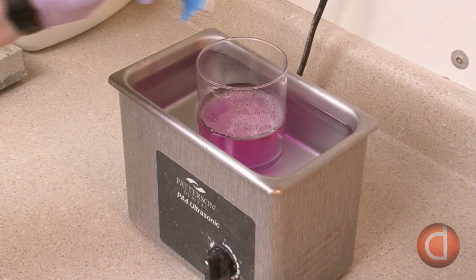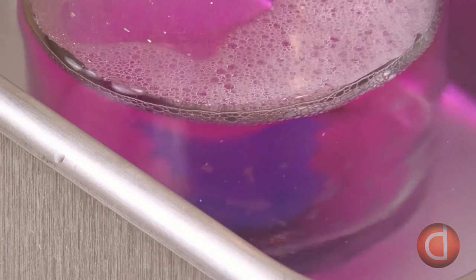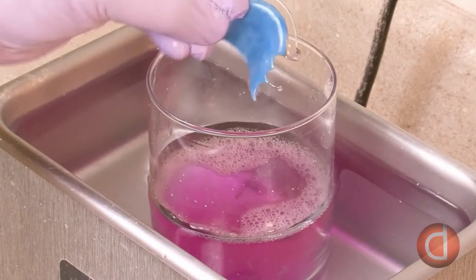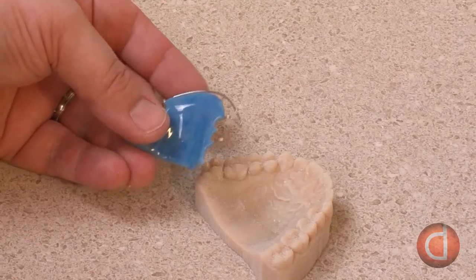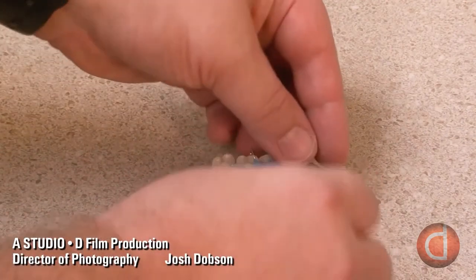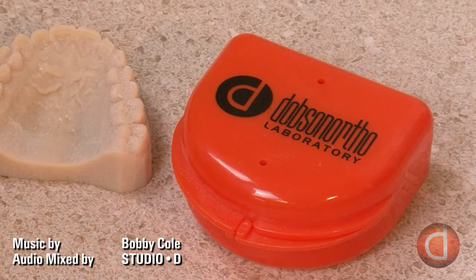The retainer is dropped into a mild acid in an ultrasonic cleaning machine for about 10 minutes. The ultrasonic waves in conjunction with the solution remove any pumice and polish residue. The retainer is then removed, rinsed with water, and dried. A QC technician inspects the finished retainer to ensure the proper wire size was used, visually inspects it, and checks that it fits properly with the model. If all is satisfactory, it is placed in a carrying case and shipped to the orthodontist.